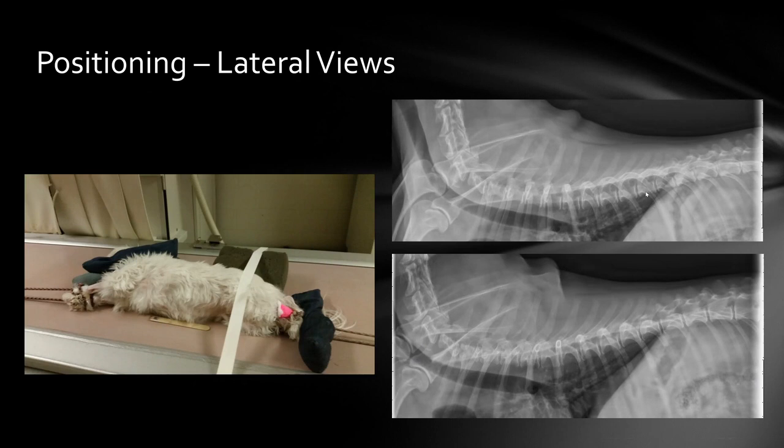This is very oblique. You see that the rib heads are not superimposed with each other. They diverge, and that really limits your ability to evaluate the spine. This again is not perfect, but it's better and was considered acceptable. At least the ribs are on the same levels, and you have a good view of the respective intervertebral disc spaces and vertebrae.